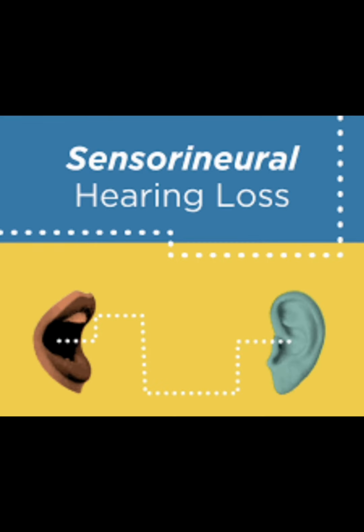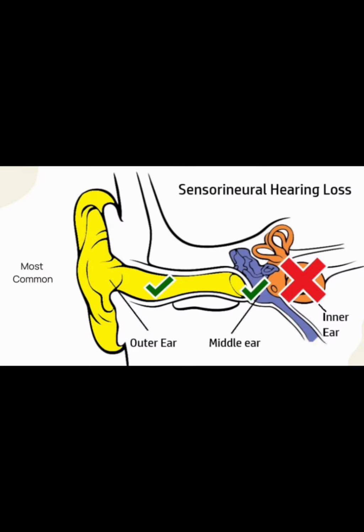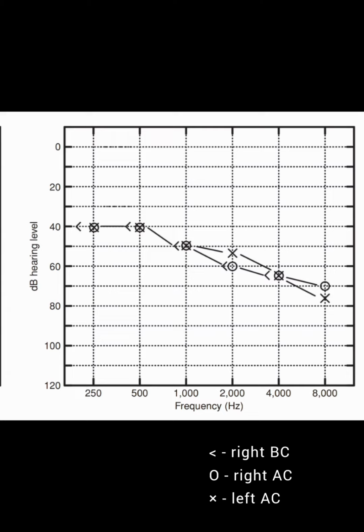Neither sensory nor neural disorders hinder energy from reaching the inner ear by the air conduction route or by any of the bone conduction routes. Changes in air and bone conduction thresholds are affected only by the damage to sensory or neural structures, which will lower air and bone conduction thresholds similarly. Air and bone conduction thresholds will therefore be similar, plus or minus 10 decibels.